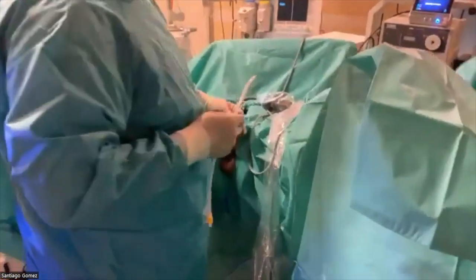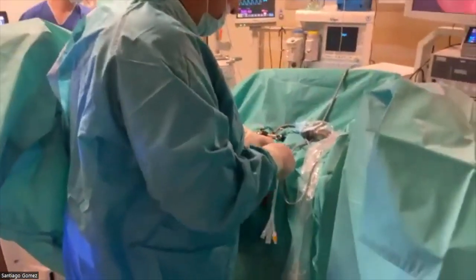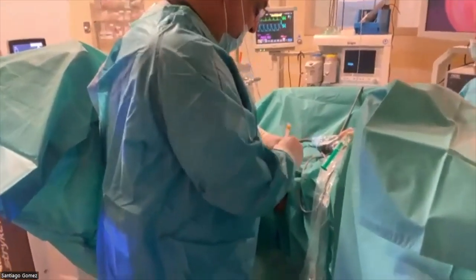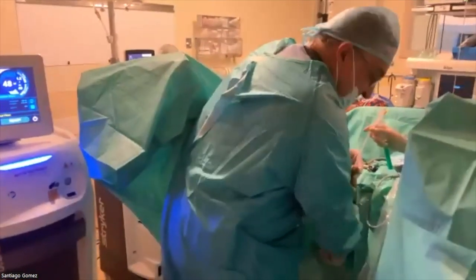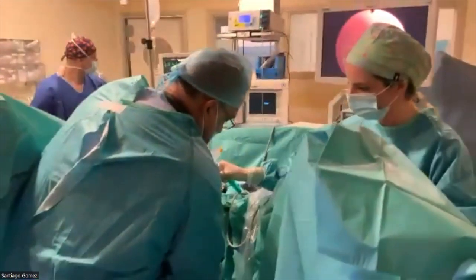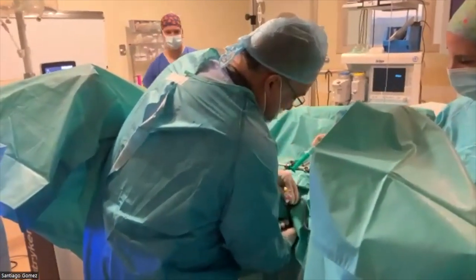Again, a catheter. Usually we use a three-way catheter. We will leave some irrigation going on, and we will tailor the speed of the irrigation to the need of the patients. No, vamos a sacar. So in this case, you see my nurse. I don't know if you're seeing this. Vale, is going to help me make sure that the catheter goes in the right place.